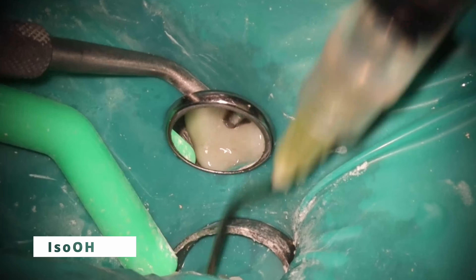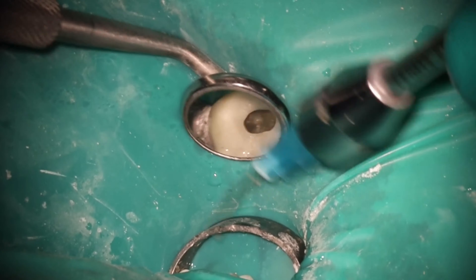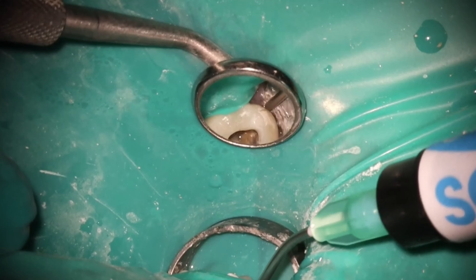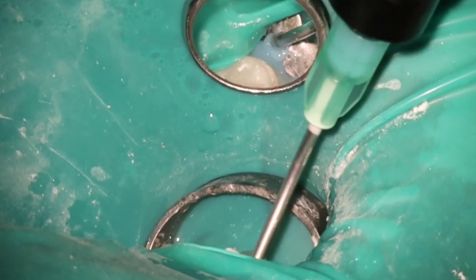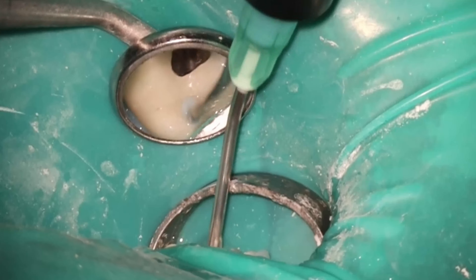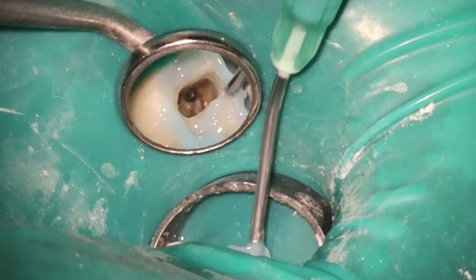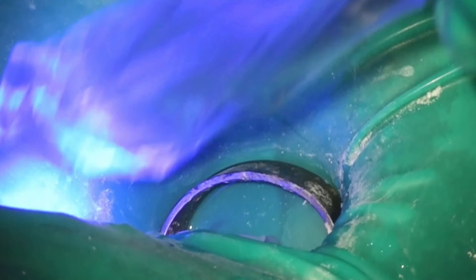We're going to talk about platform building real fast. What we're going to be doing is using the GentleWave, allowing you to more predictably one-step retreats. First thing you want to do is make sure it's as dry as possible — that's what the isopropyl alcohol was for. It evaporates really quickly and makes it so the SoundSeal almost sticks to the lithium disilicate or tooth structure. The next thing is to go around the rubber dam and seal it with the SoundSeal.